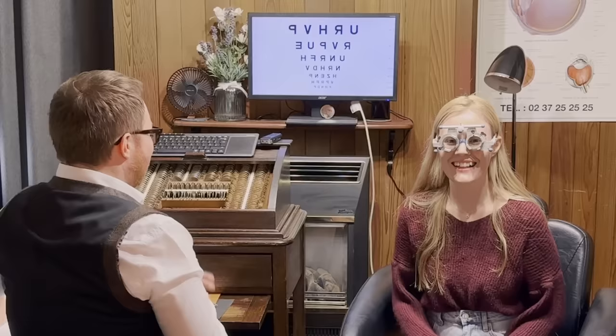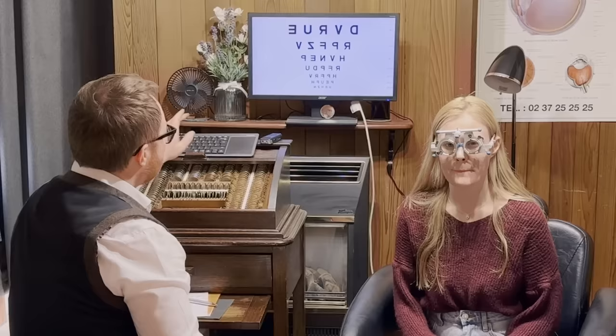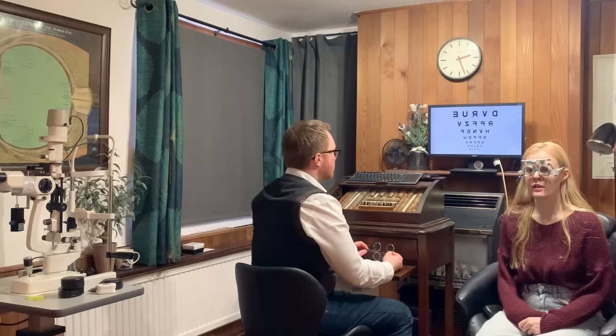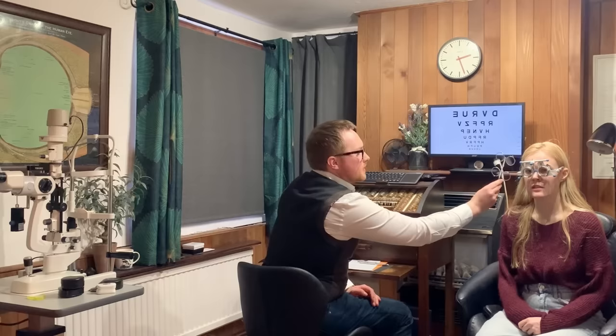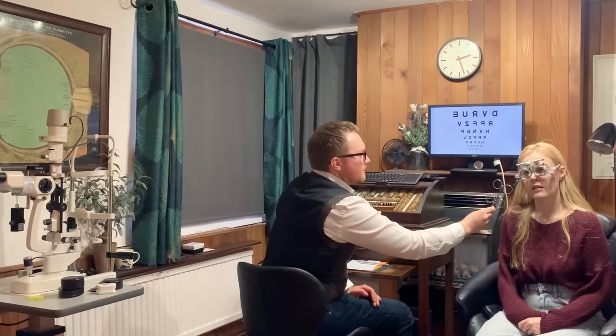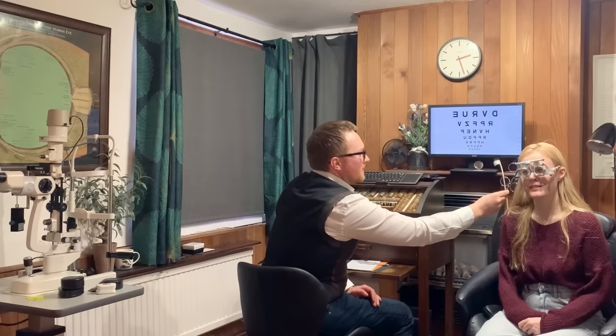And with both eyes together, what would you say is the smallest line you can get there for me? Probably second from bottom. Yep. P. E. Mm-hmm. Excellent. So as you're looking at that line of letters, I'm going to put this in front. Has it made them a little bit better, a little bit worse, or about the same? So that's with, and that's without. There's with, and there's without. They're not exactly the same, but they're both good. Okay, that's fine. One's older and one's like further away or something.